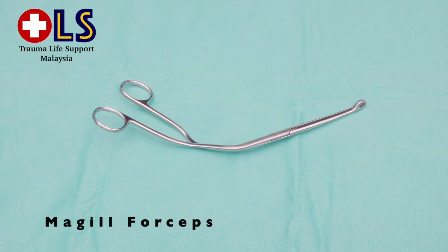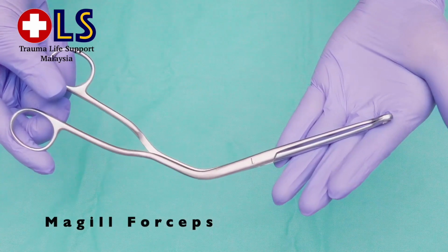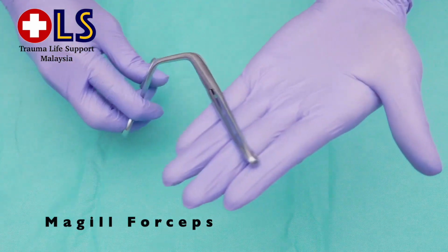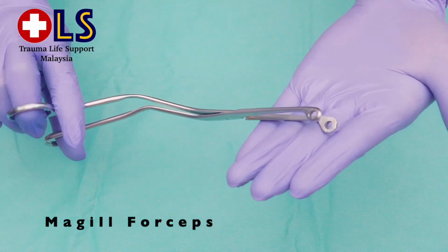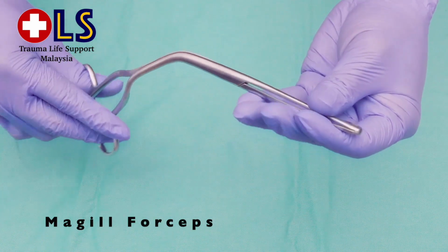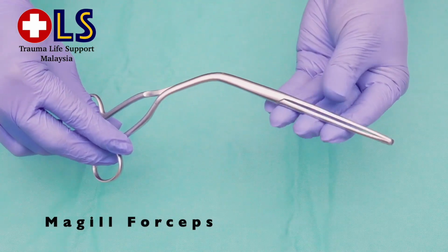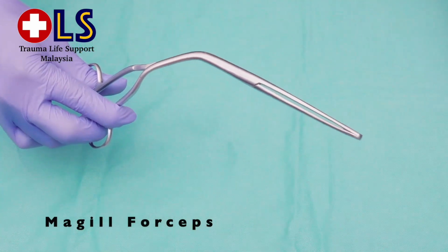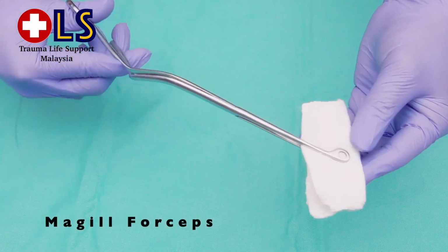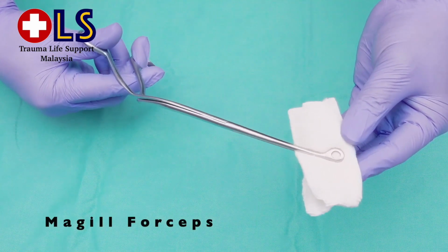This is a Magill Forceps, an additional instrument that you need to prepare if you are going to intubate a patient. It is a twin-bladed, tong-like forceps. It has a rounded end for grasping and an oblique angle between the head and the body so that the view would not be obscured. Among the usages are: it can remove foreign body, it can be used to manipulate soft tissue to facilitate intubation. It can also be used as an aid in pharyngeal, laryngeal packing in case of bleeding. And it also helps ETT, nasal ETT, or orogastric tube insertion.